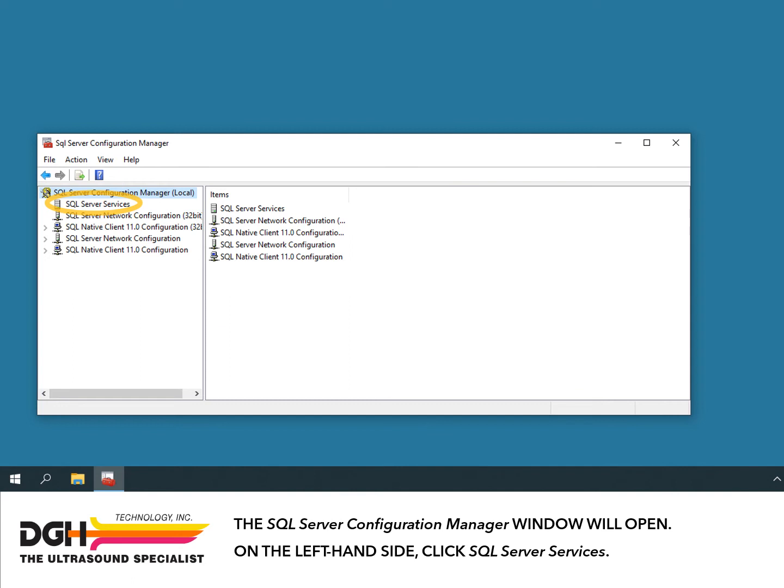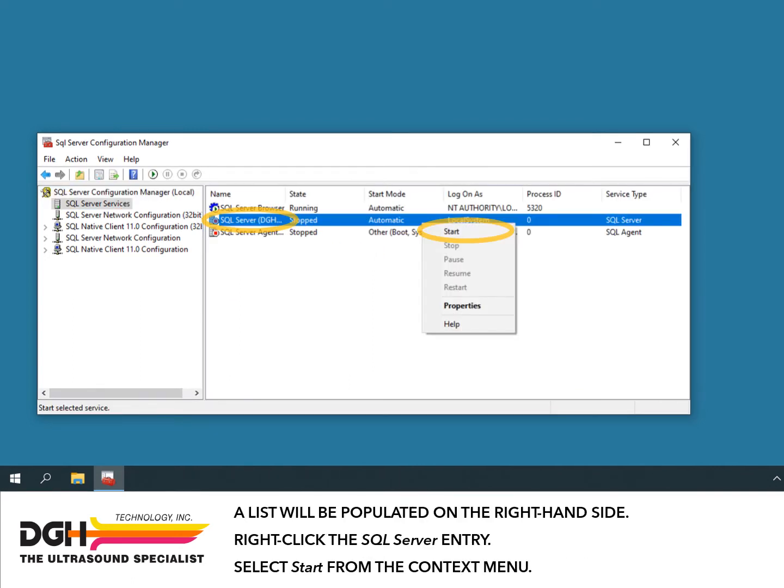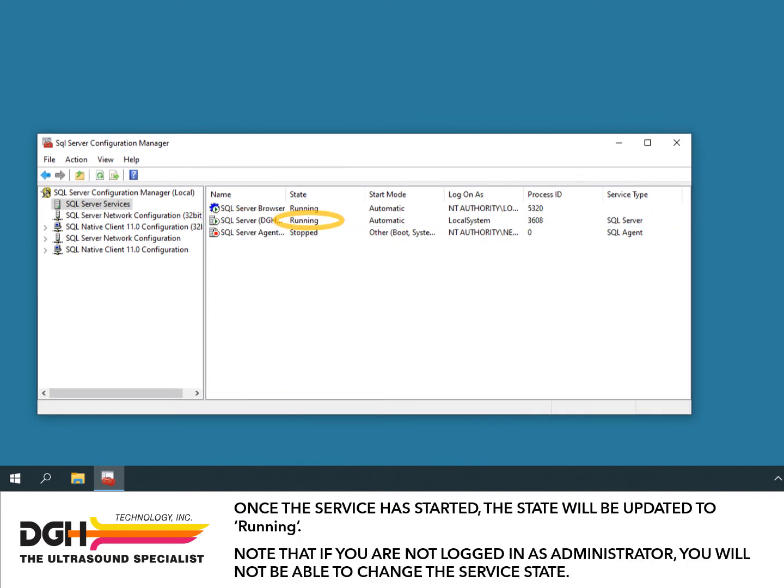On the left-hand side, click SQL Server Services. A list will be populated on the right-hand side. Right-click the SQL Server entry. Select Start from the context menu. Once the service has started, the state will be updated to Running. Note that if you are not logged in as administrator, you will not be able to change the service state.